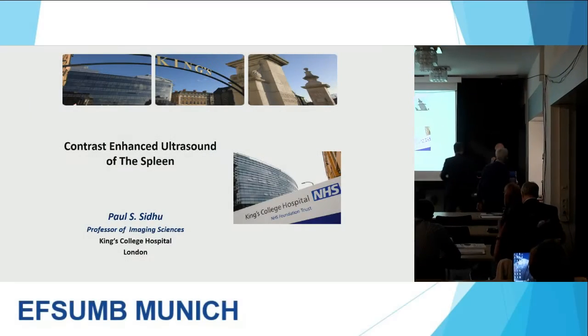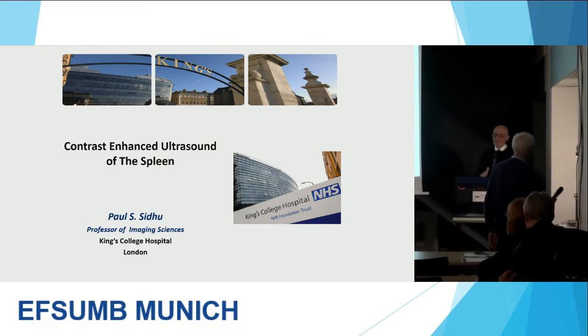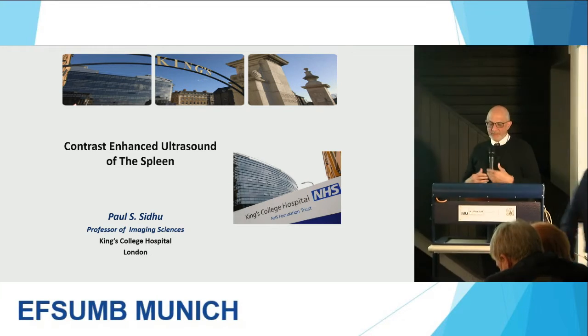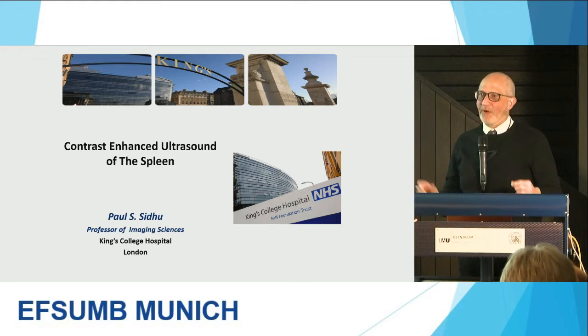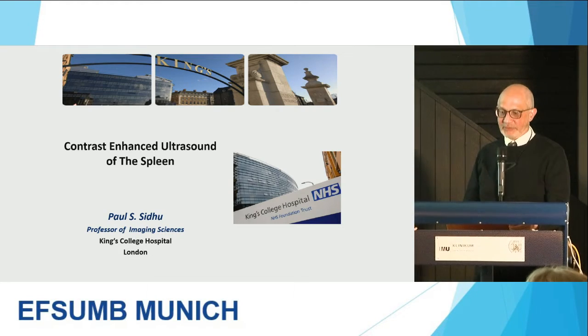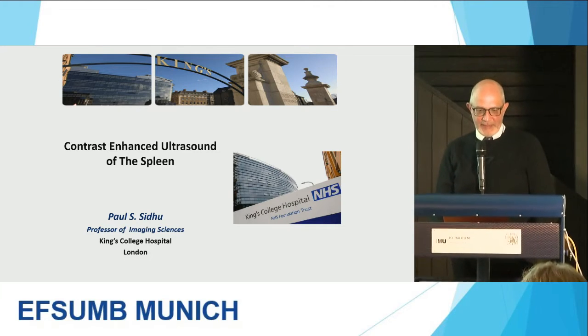What I'm going to do is the trauma lecture, then speed into the spleen lecture, and then speed into the trauma lecture by using the spleen as an example of where you use contrast-enhanced ultrasound in trauma. So the spleen is the forgotten organ.